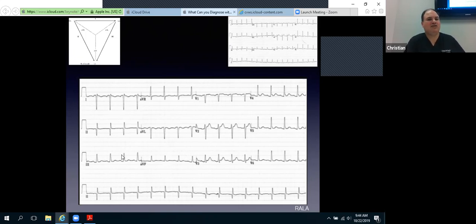So now we're flipping all of these around, right? Lead 1 is completely reversed, and now the left arm being over here is going to be read as LA to LL in reality, but it's going to be read as lead 2. And it goes on and so forth.